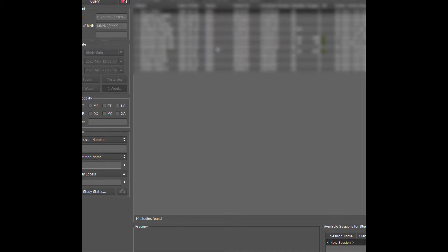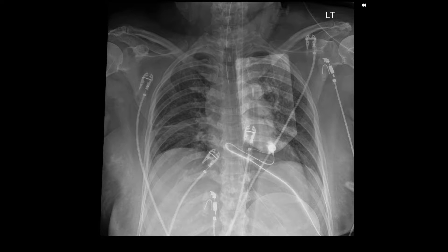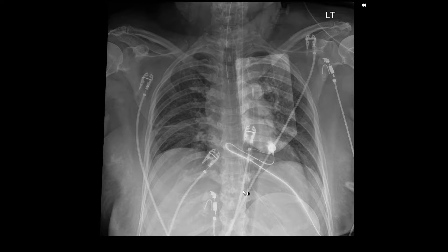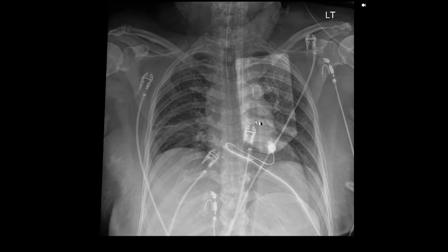First, we'll talk about intra-aortic balloon pumps. These are inserted through a femoral artery in the groin and positioned within the descending aorta. The balloons inflate in the diastolic phase to provide pressure for coronary perfusion during diastole, and deflate during systole for afterload reduction. These balloons are quite long and typically have at least one radiopaque marker on the cranial end, and may have a second radiopaque marker on the caudal end, though that is variable.